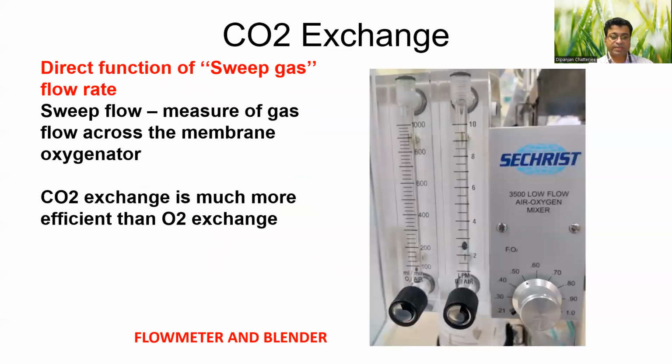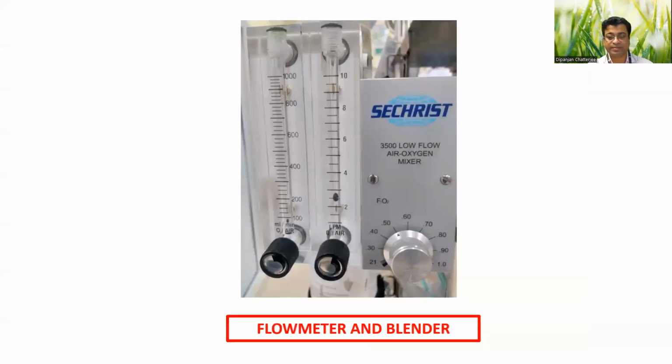So the CO2 exchange depends upon the sweep gas rate. It is not how much oxygen we are giving, it is the sweep gas rate. Like if the CO2 goes up in ABG, if the patient is on a ventilator, what you do is you increase the rate, increase the tidal volume. But here you have to just go up on the sweep gas rate.